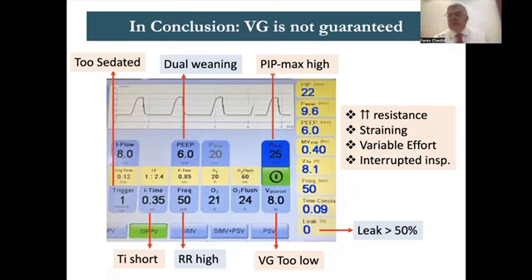Volume guarantee should not be used for chronic patients, because it's only for dynamic patients. As I often say, when you take Muhammad and you give him surfactant, he becomes Ali, a totally different patient. So in those patients who are changing so quickly around birth, volume guarantee is very relevant. But in chronic patients, you will get all the side effects of volume guarantee if you use it. You know their lungs have been the same for weeks. They are not going to change quickly.